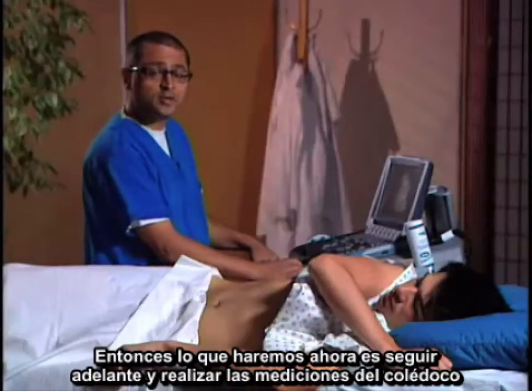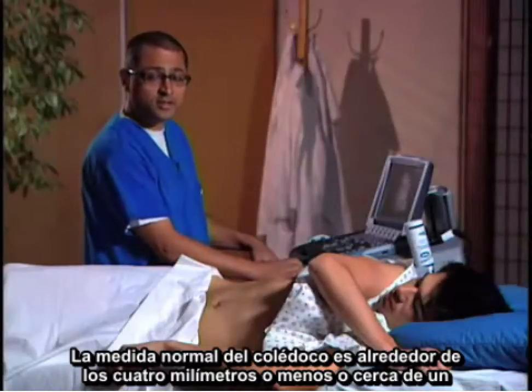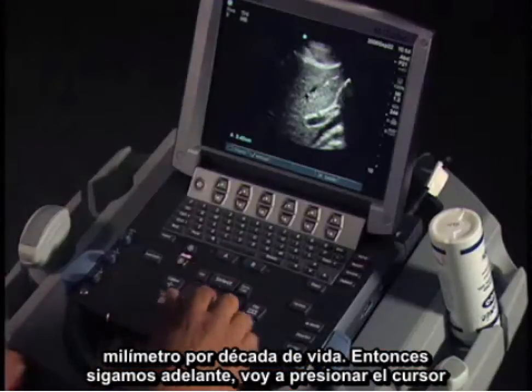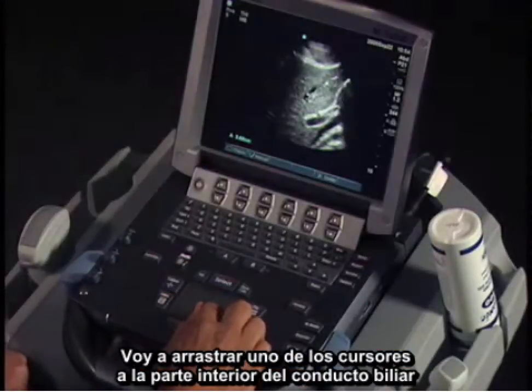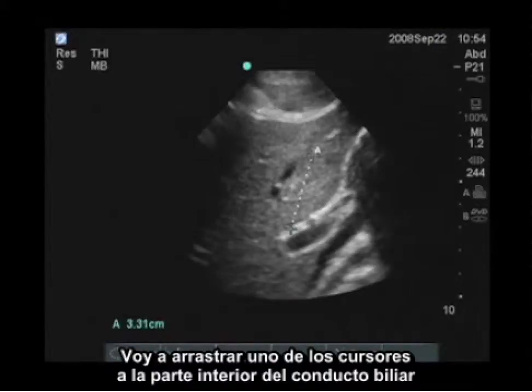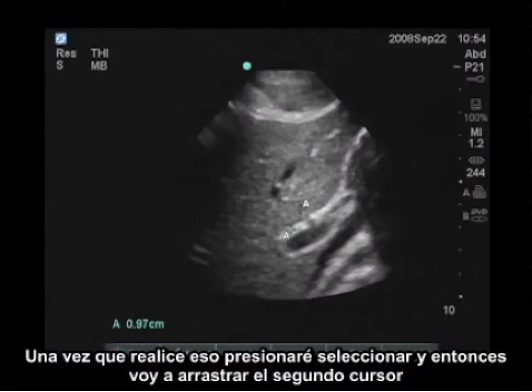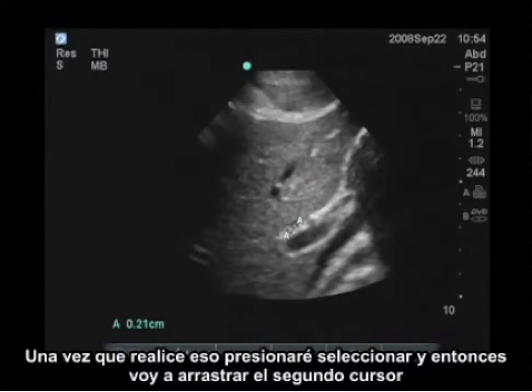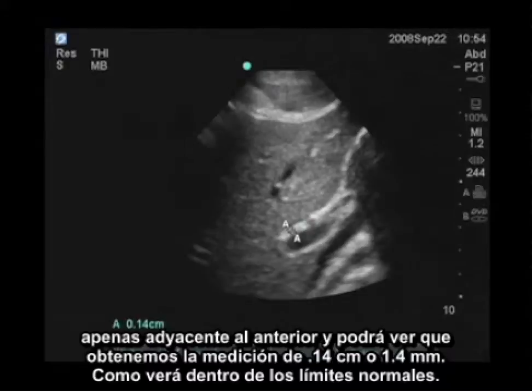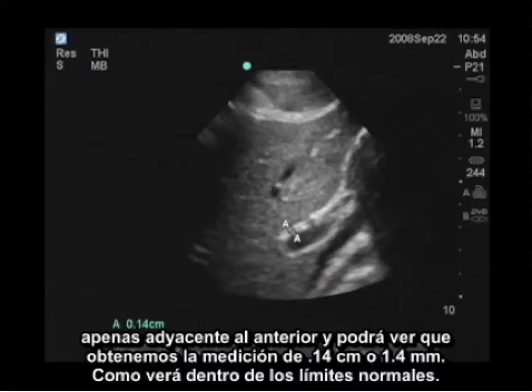What we're going to do now is go ahead and measure the bile duct. A normal bile duct measurement is about four millimeters or less, or about one millimeter per decade of life. I'm going to hit caliper and drag one end to the inner aspect of the bile duct. Once I have found that, I'll hit select and drag this down just adjacent to it. We're getting a measurement of 0.14 centimeters, or 1.4 millimeters — well within normal limits.